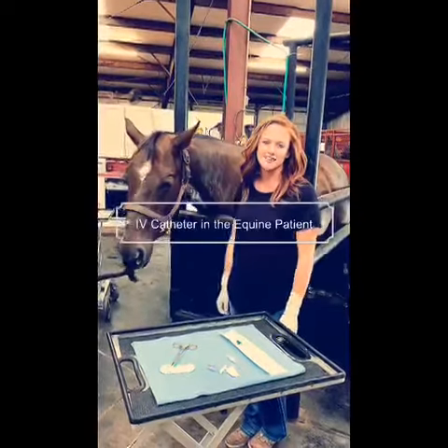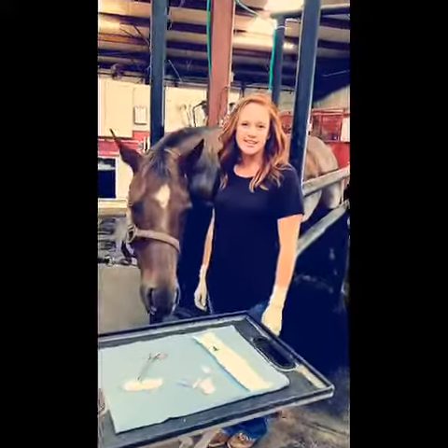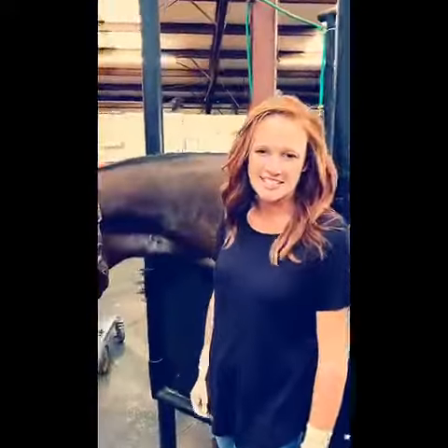Hi, Dr. Kayla DeVue here at Interstate Equine in Goldsby, Oklahoma. Going to walk you through the process of putting in an intravenous catheter in our equine patients today.